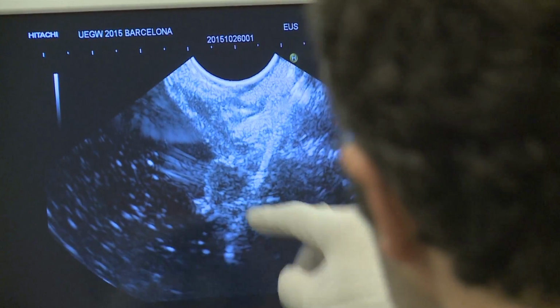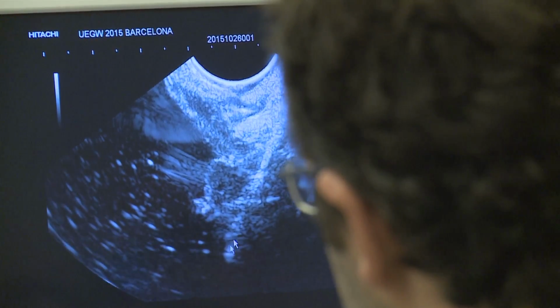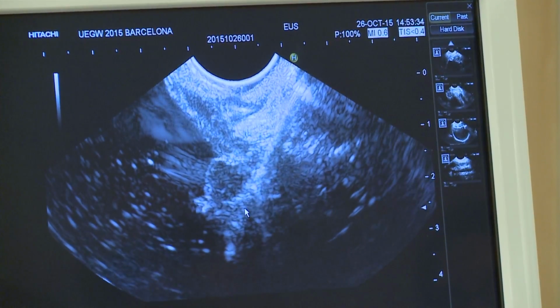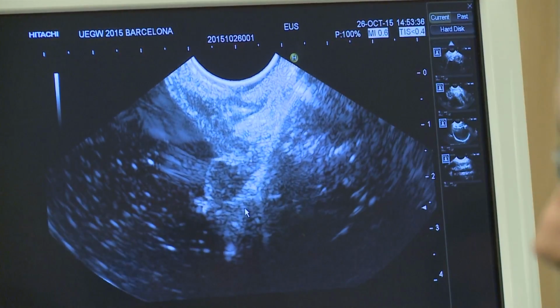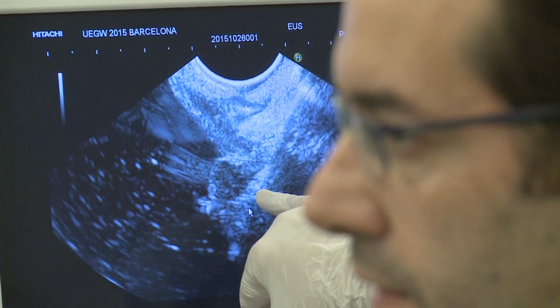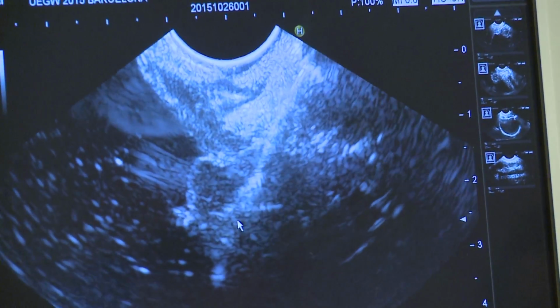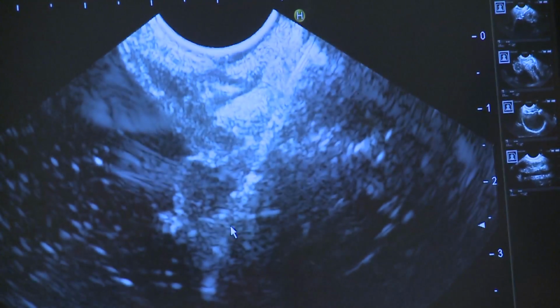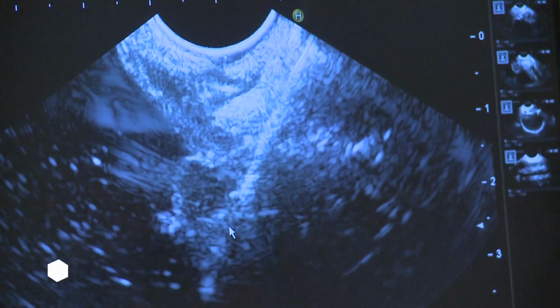Here. This is an artifact, because if you have any doubt, you see, the Cook needle has a very wide tip in the very tip. So you can easily see where you have the tip of the needle. Okay? So here we are inside. Now we can remove the stylet.